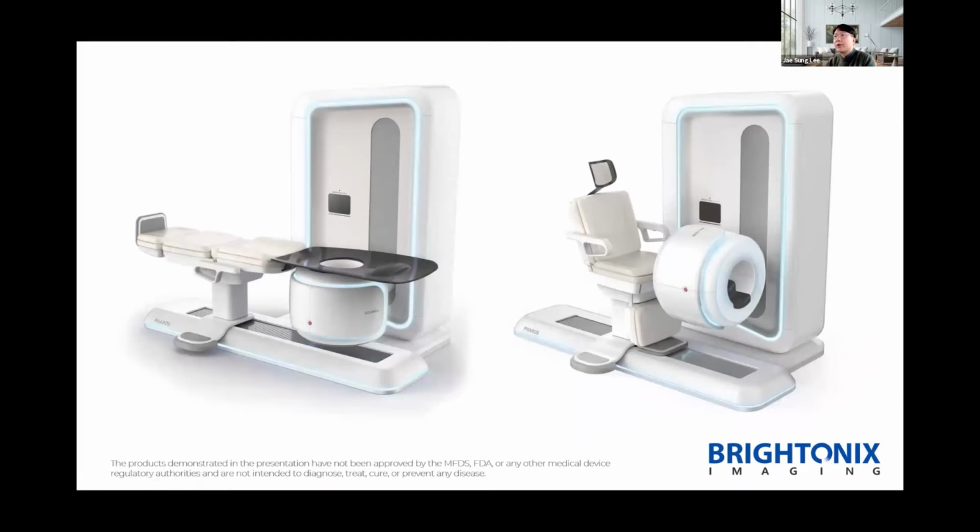We can also transform this system to have the detector position in this way. So if we place the PET detectors in this way, we can employ this system for women's breast imaging, and some additional peripheral imaging will also be possible if we turn around the patient chair in this way. So I think you can think about further application of this system for your patients.